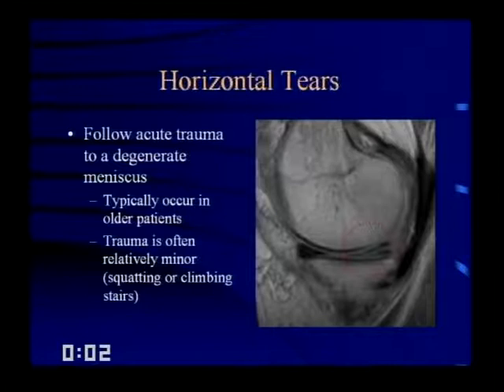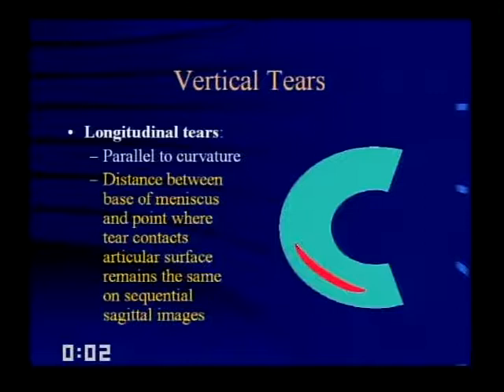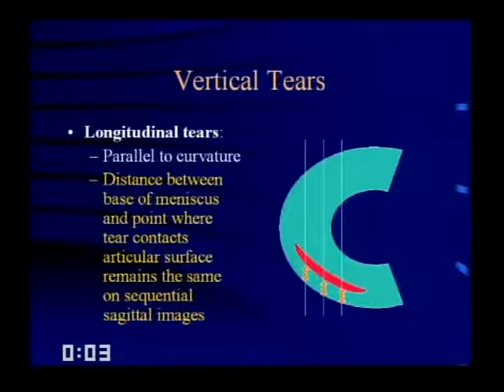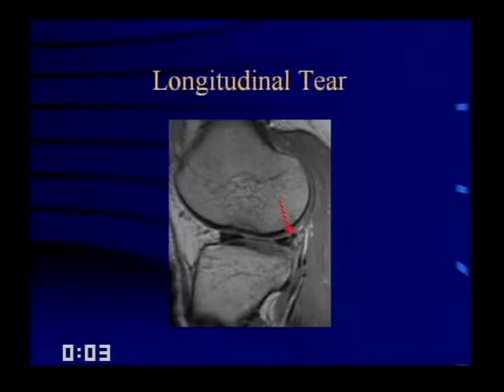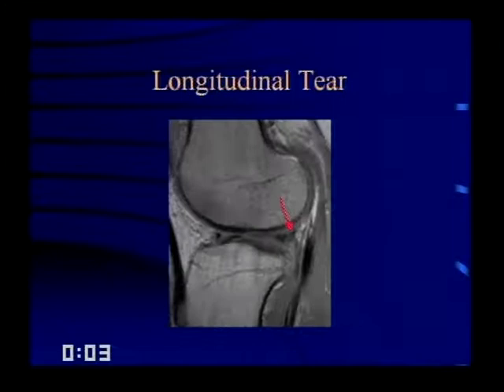Longitudinal tears are a type of vertical tear that run parallel to the curvature of the meniscus. The key to recognizing these is that the distance between the base of the meniscus and the point at which the tear contacts the articular surface remains the same on sequential sagittal images. Here's an example of a longitudinal tear of the posterior horn — you can see it on successive slices, same distance from the base of the meniscus, paralleling that curvature.